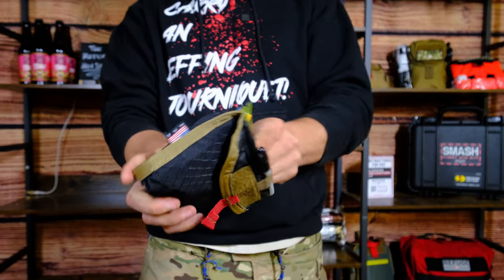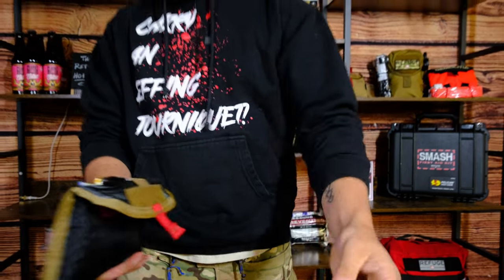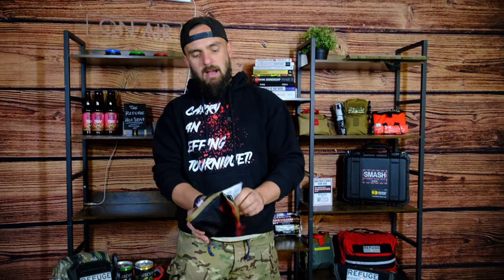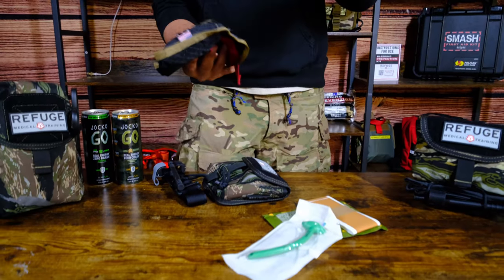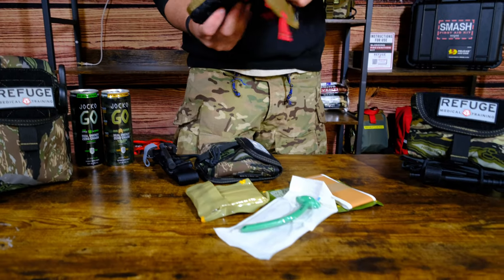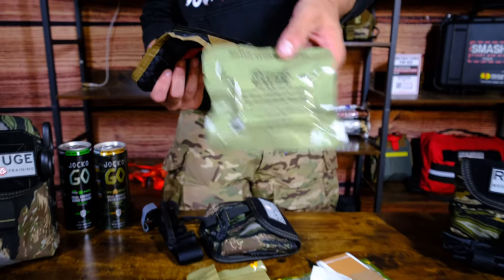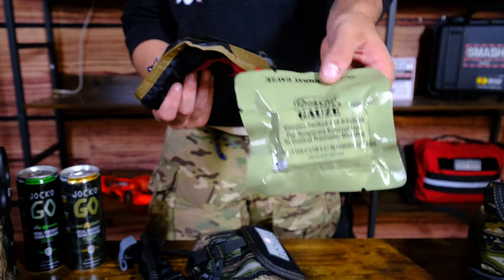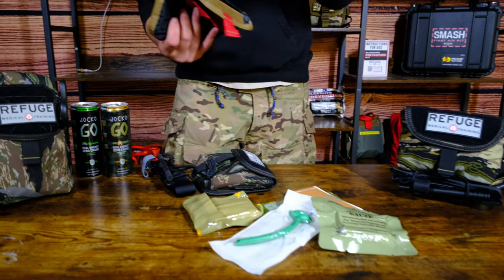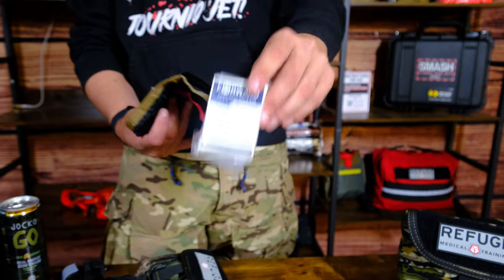You can take this whole stack right out of the pocket and you can see you have your halo chest seals, flat duct tape, your 5x9, an NPA, and a small emergency trauma dressing from Forward. We also put combat gauze in there, which is a hemostatic impregnated Z-fold gauze for wound packing — one of the best on the market.